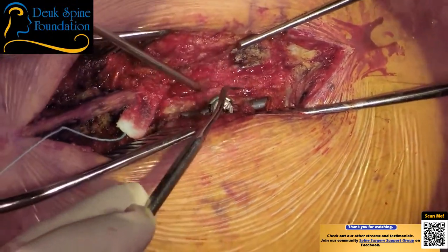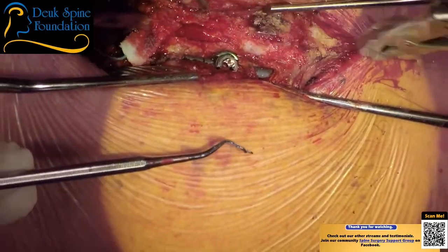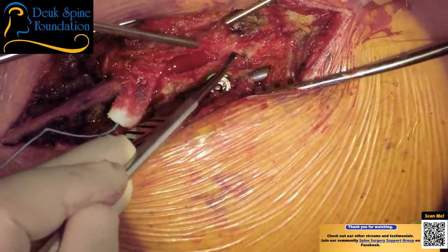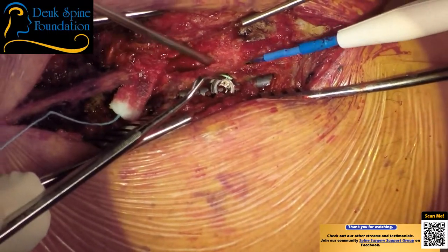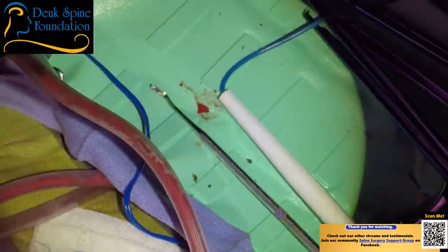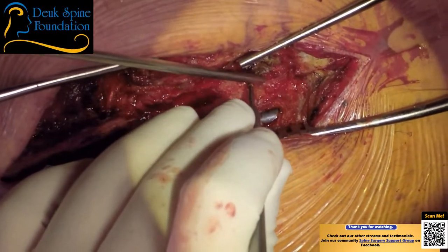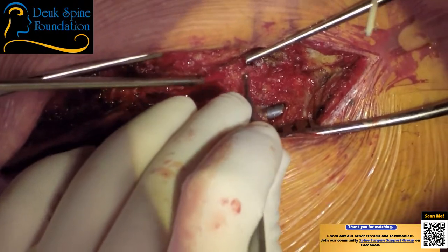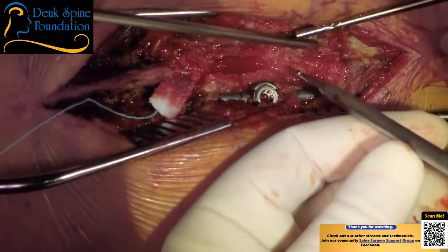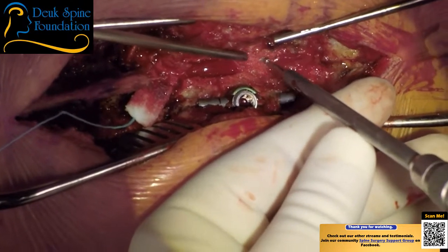Yeah, I've got to figure out where we are. I think that's just scar tissue there. Question is, where's the lamina? I've got to drill down on that lamina. The anatomy is eluding me. I don't know if some of it was removed or just rotated. But this is bone. So I know I need to remove this bone here, at least, in order to get further north. So I have to bridge this gap right here. That's where there's some compression. And to do that, I need to get rid of some of this bone.